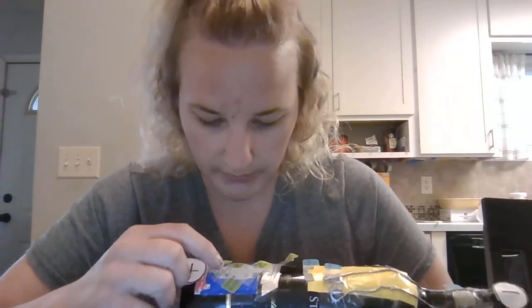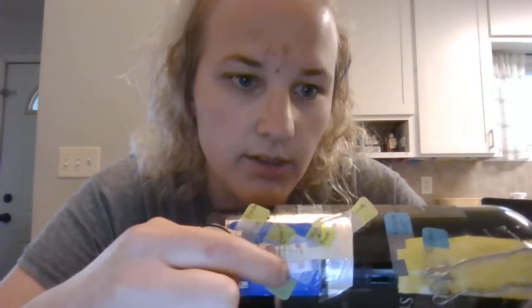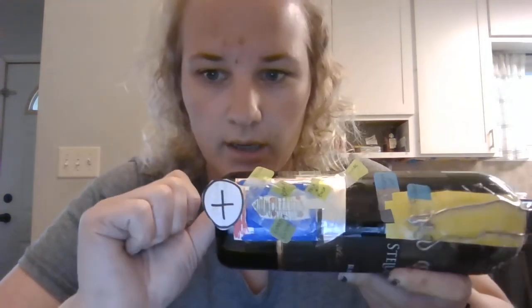Inside of the rotor, we have the bearings, which are these little circles. They are made out of silver-plated steel balls because they can be used as a lubricant between the cylinder and the anode shaft, since liquids tend to create gases at high temps.